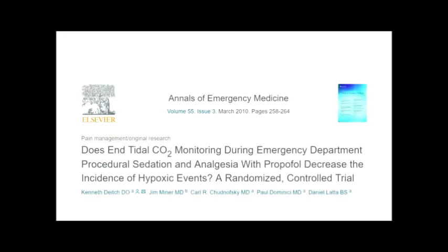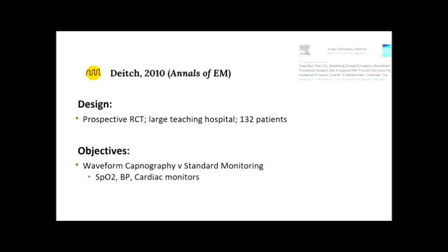And when people talk about the advantages of using capnography, they mainly refer to this paper in 2010 from the Annals of Emergency Medicine by the Deitch group. And it's titled, "Does End-tidal CO2 Monitoring During ED Procedural Sedation Decrease the Incidence of Hypoxic Events?" So it's a prospective RCT, a randomized control trial, that was done at a large teaching hospital and included a total of 132 patients.